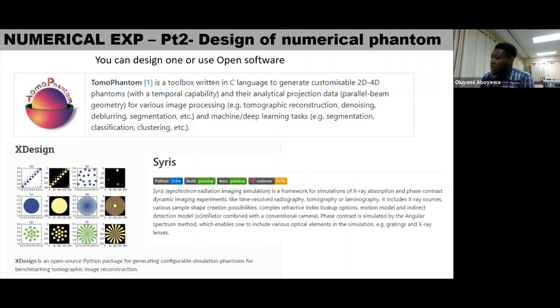I think TG291 also mentioned something like that, where they had the first publication, this Alves, what's the paper? I don't know how to pronounce that name. Sorry. Albert Markovsky and Robert, I'll just call it. One of the papers that the author cited was a 1976 paper, and that author gave an example using lesion characterization, like you mentioned already. From the onset, we want to get the electron density. If we mistook it for something else, which it is not, then we treat it as such. So I think it may be good in the planning algorithm.